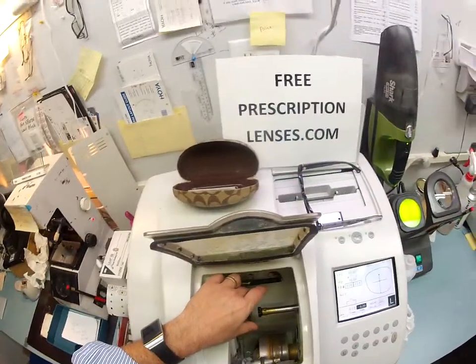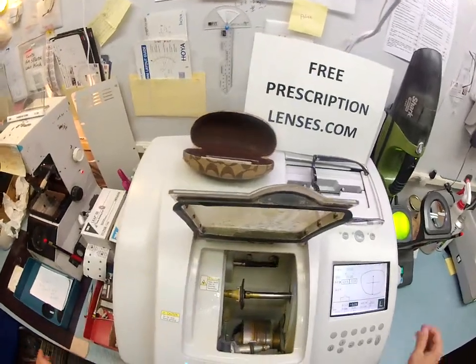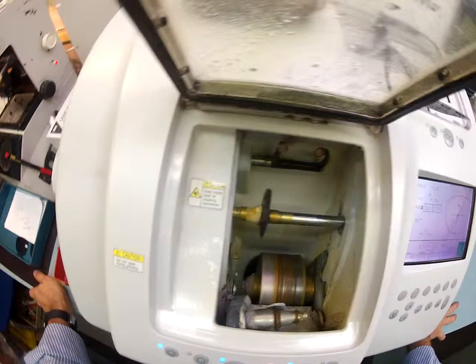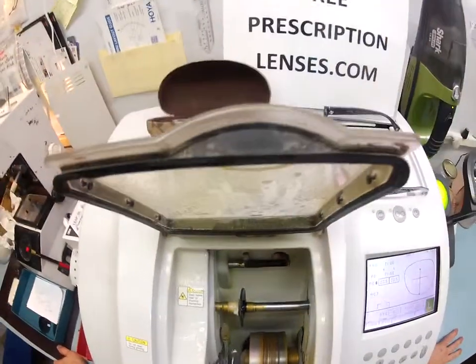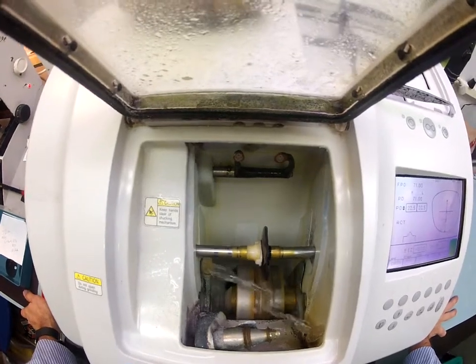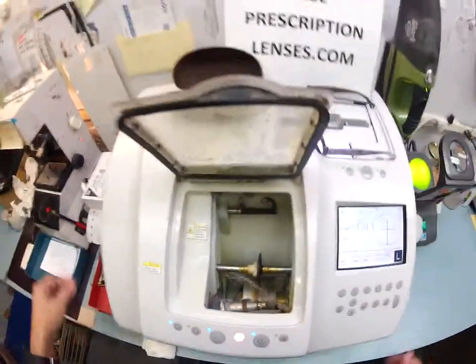Now your left lens is slightly stronger than your right lens. That's why it needs a little bit more. A little bit mo, as I like to say. Hey Mo. So it's not going to go onto the cutting wheel. It's just going to go back to the bevel wheel. And 1/10 of a millimeter is going to come off.